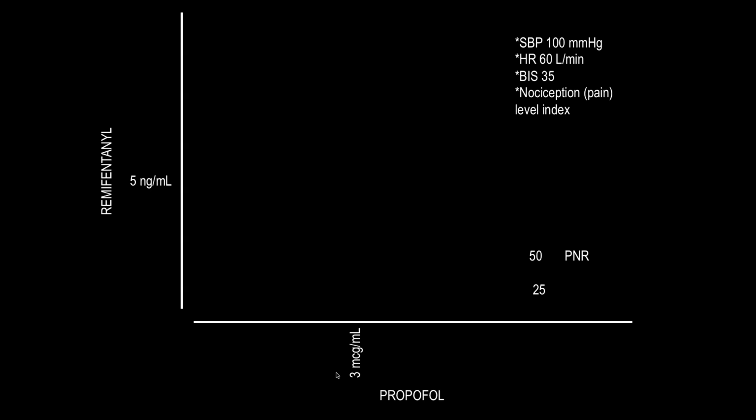If this is not done, when the hypnotic is diminished, the anesthesiologist will meet a patient who leaves the appropriate plane for the procedure. The difficulty in this situation is how to calculate the infusions of the drugs to continue in the same analgesic plane and raise the BIS.